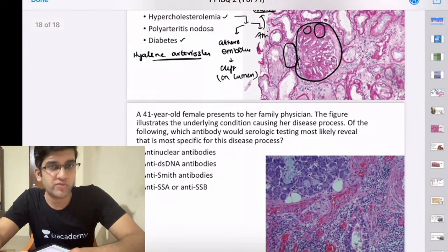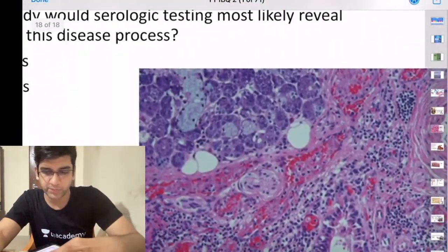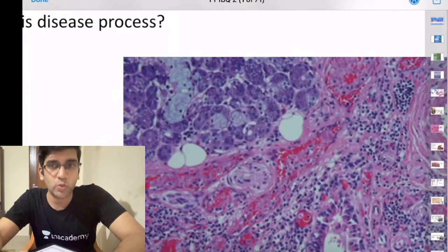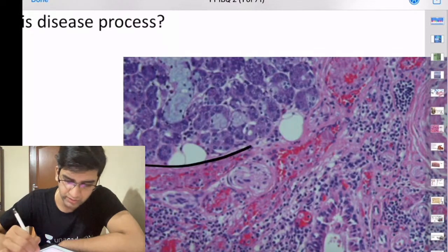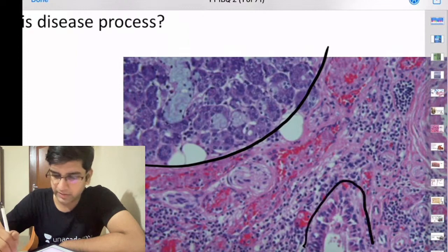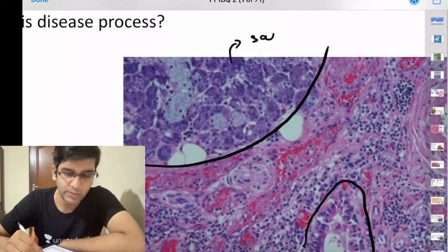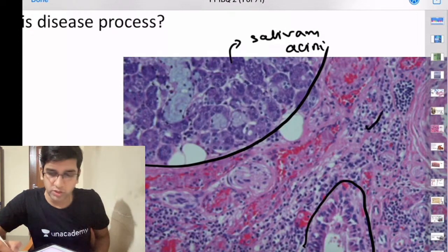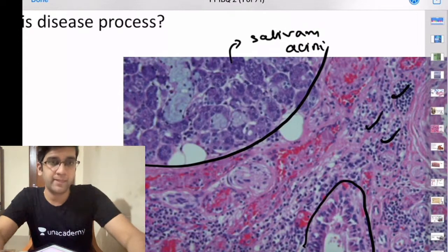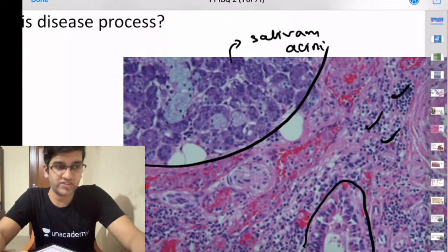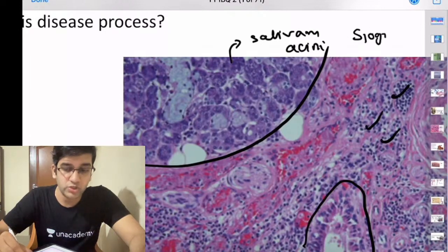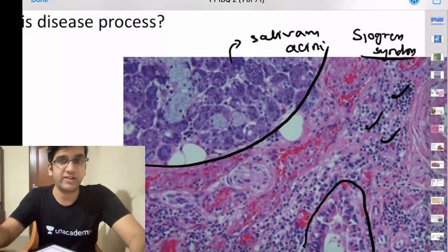Last question: a 41-year-old female presents to her family physician. Looking at the image — these are salivary acini. This is a salivary gland biopsy with lots of lymphocytes destroying the salivary gland. Primary diagnosis: lymphocytes destroying salivary gland — that's Sjögren's syndrome. Minor salivary gland biopsy is one of the diagnostic findings in Sjögren's syndrome.